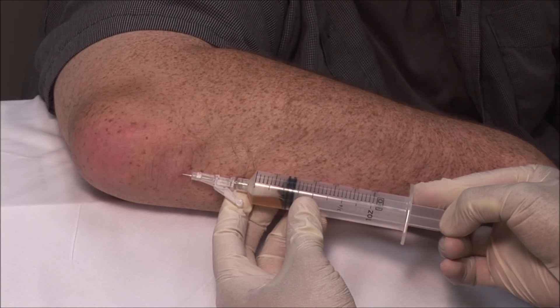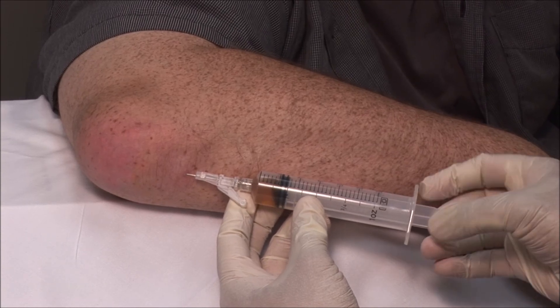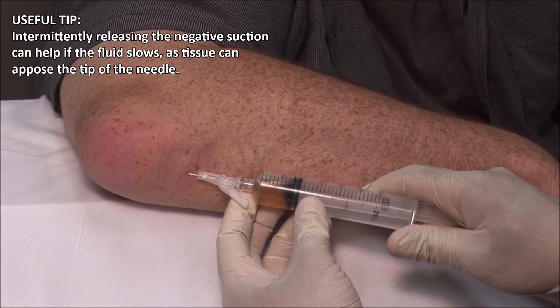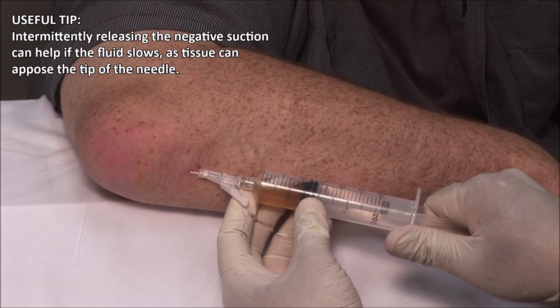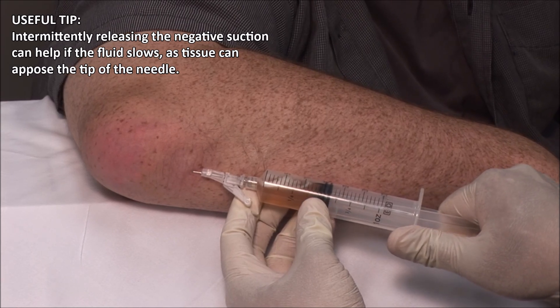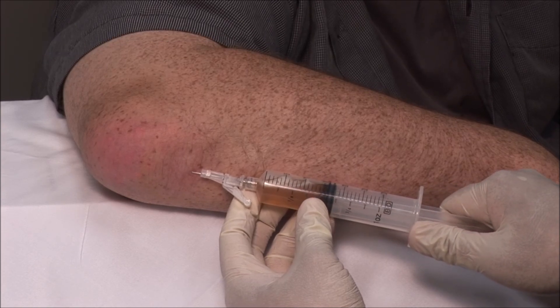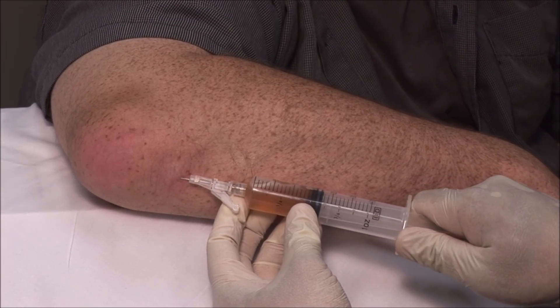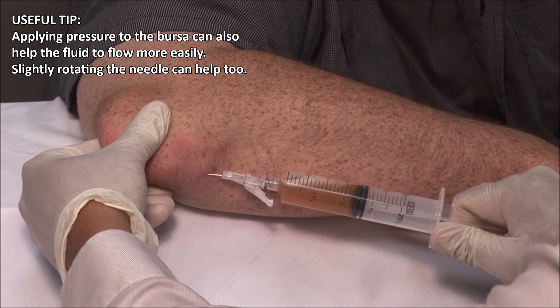Occasionally, if the effusion is loculated, you may need to make several passes with the needle. It is a good idea to apply and release the pressure. You can also stabilize the bursa and apply some pressure to help the fluid to escape.